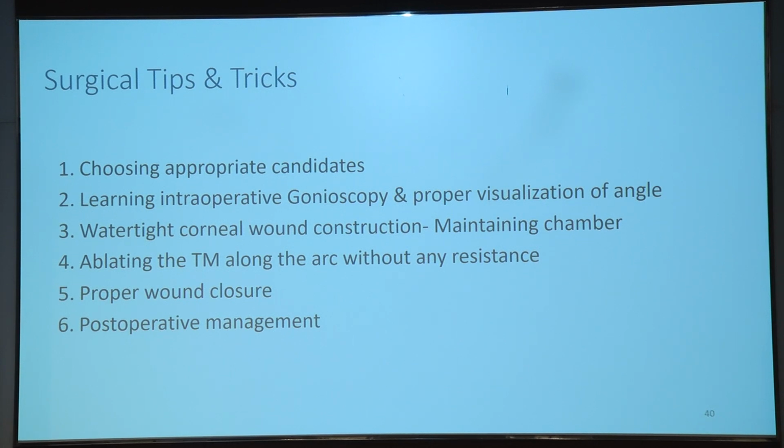So there is definitely a wider scope for these procedures in the coming days. Thank you very much.